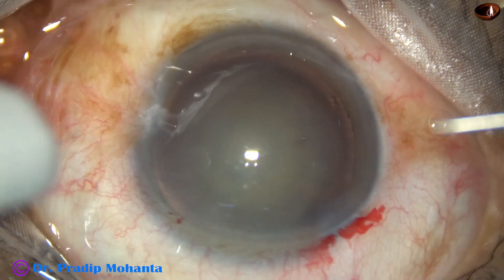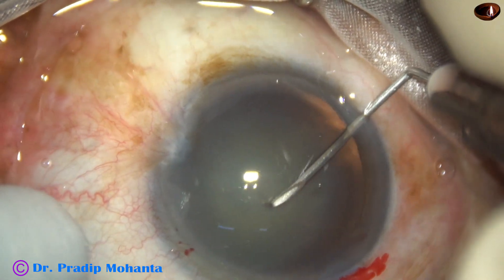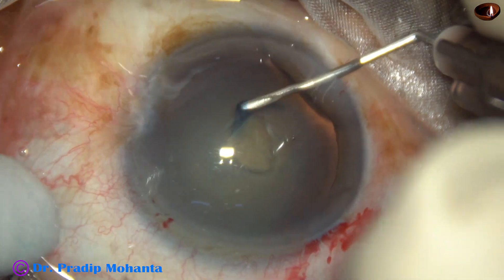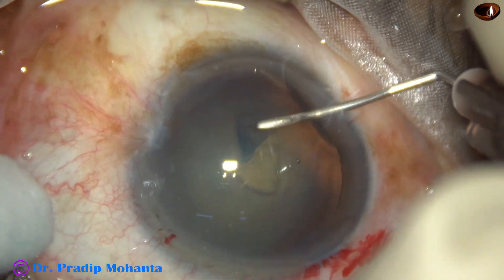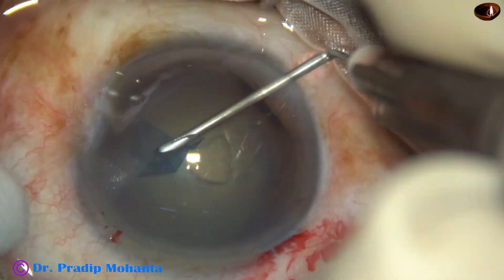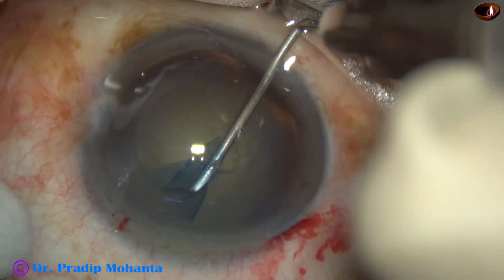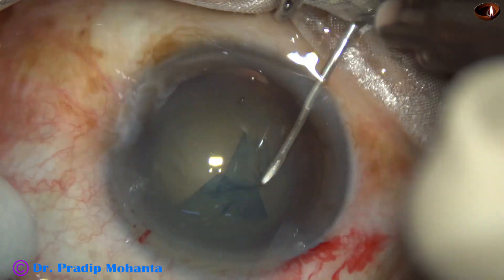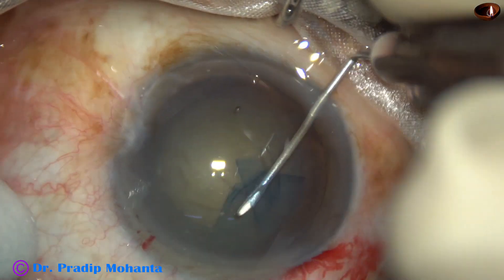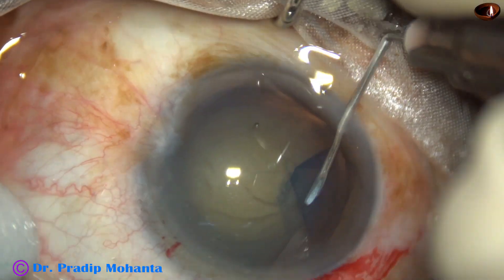And now, capsulorrhexis. Let us do it with a needle in this case. Incise, pull the capsule, flip this capsular tag — so your needle is on the under-surface of the capsular tag. The capsular tag is guided all around, and a fairly round, adequate-size rhexis is achieved.